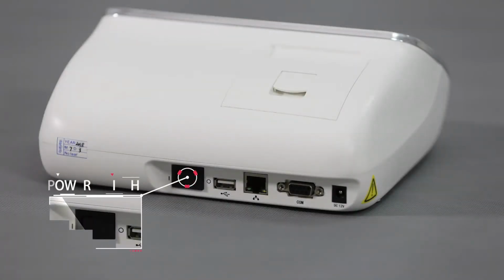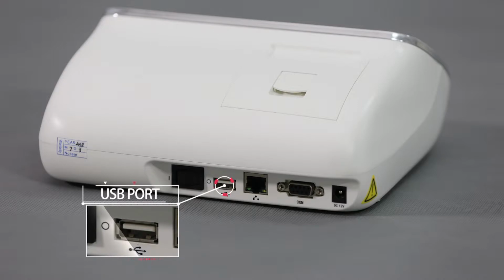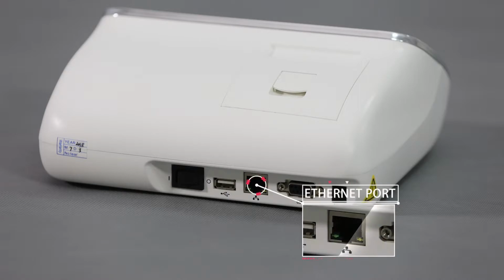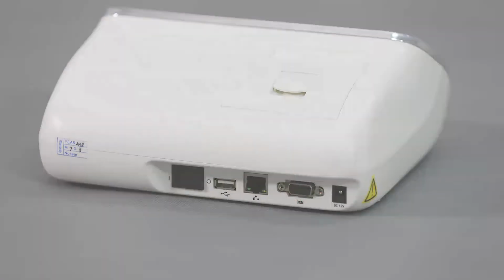The rear end of the instrument has a power switch, power port, USB port for software upgrade and optional barcode scanner connection, Ethernet port for LIS, and COM port for PC connection, LIS, HIS.